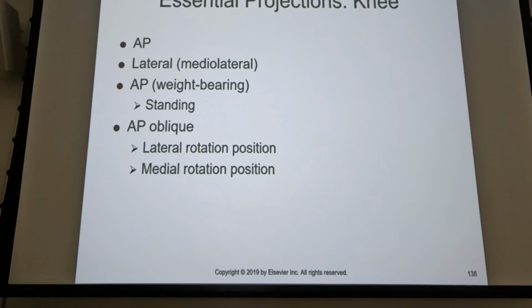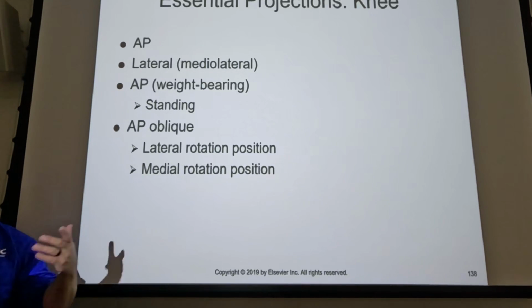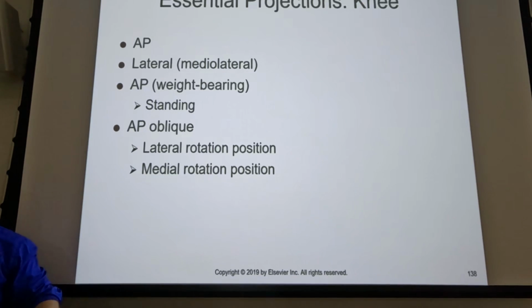I missed something in feet. Okay, so in foot, sometimes we do weight bearing too, and this won't take but a second. But with weight bearing feet, what we're looking for is the longitudinal arch. How flat footed is the patient actually?